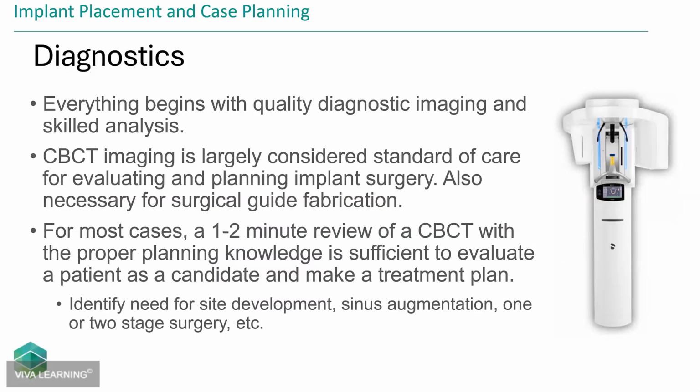But like I said, everything starts with good imaging. I would shudder at any dentist that's placing implants without a 3D x-ray. It's been a godsend for me. I would never go back from 3D x-rays. I think it's very, very much becoming the standard of care.